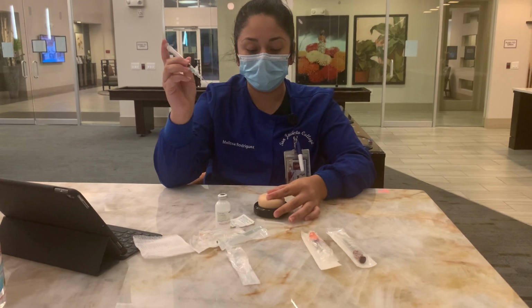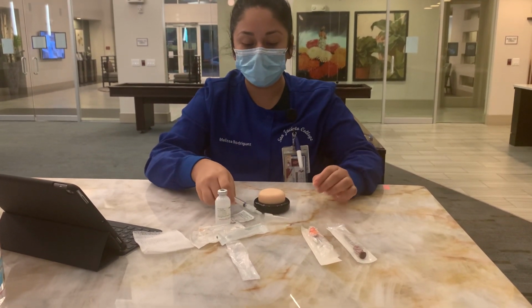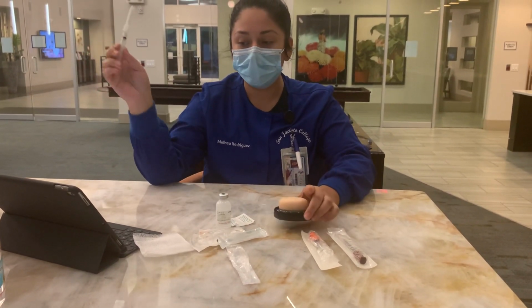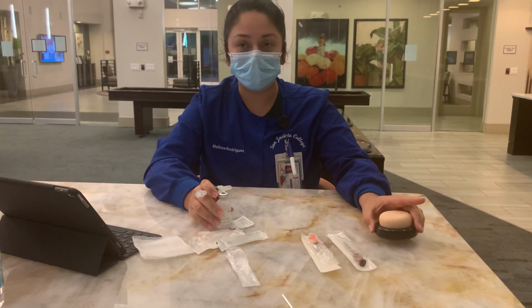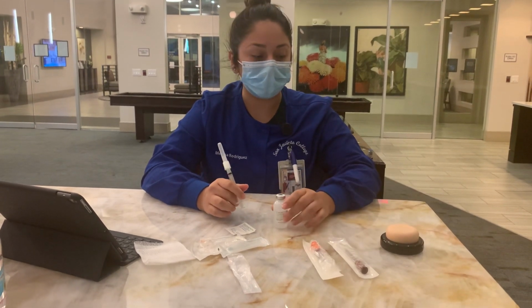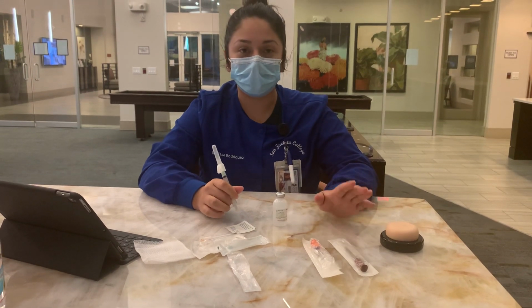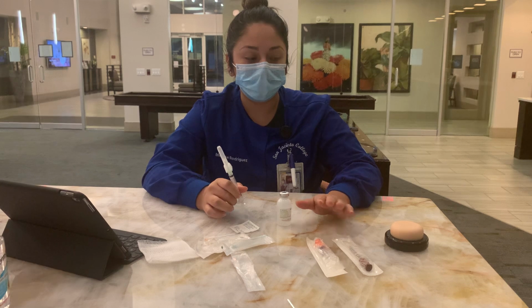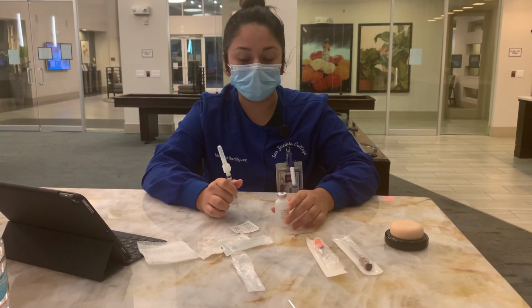pull the needle out, remove my fingers from the skin, recap the needle, and dispose of it in a sharps container, and document that the injection was given. I'm also going to assess the site after it's given, and I am going to inform the patient they're going to stay 30 minutes until I reassess and look out for any reactions to the medication given.